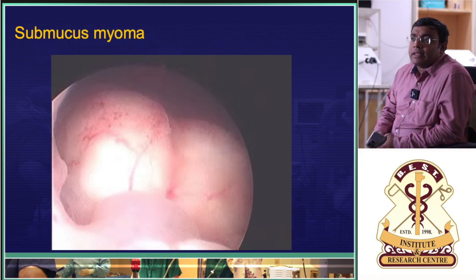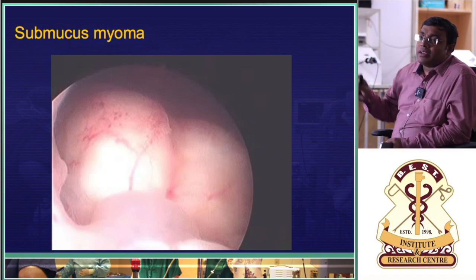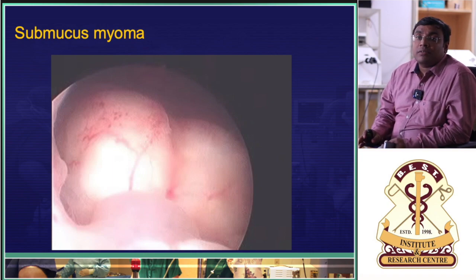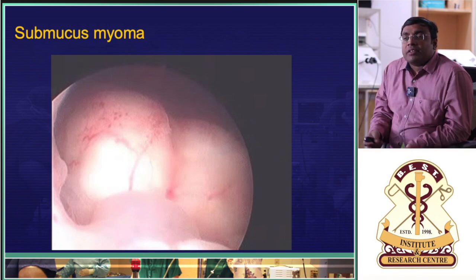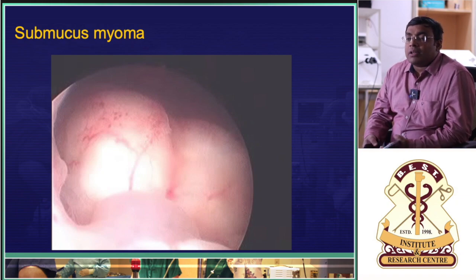Okay, one. Then myoma will be very... see, what are you seeing? So appearance is what you should talk about. Appearance gives a lot of information, because based on appearance only you are identifying the structures. Feel, touch, nothing is there. So how does it appear?